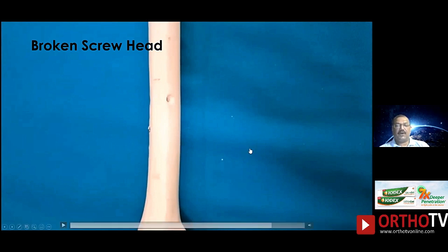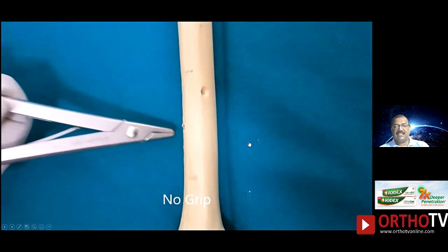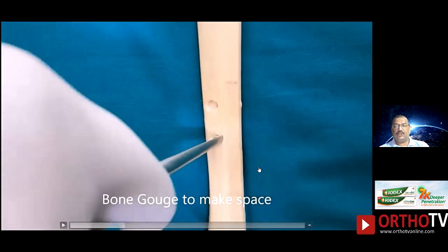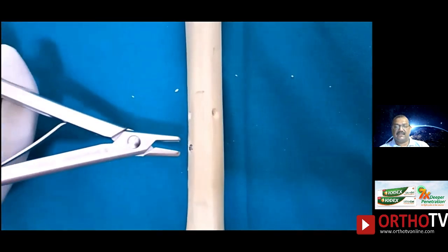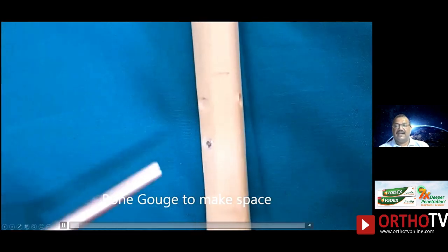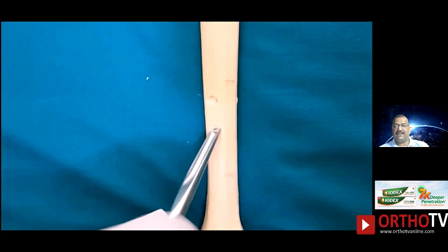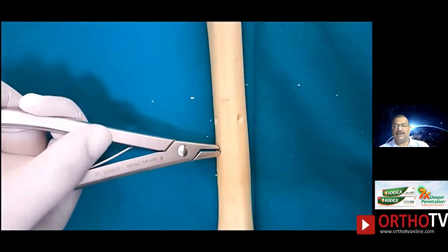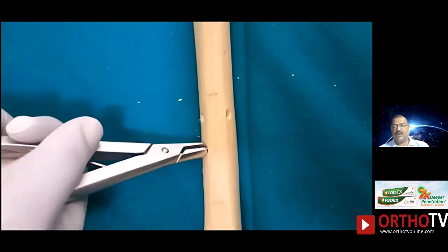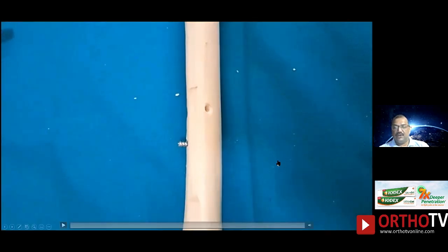Second scenario: if the screw head is broken. In this situation you can't really use a reverse tap because there is nothing to hold the head — your screw holder will simply slip off. In this scenario, what you need to do is make space by gouging out the near cortex using a bone gouge. Once you gouge it out, you can get a better grip. Use a bone gouge to make space around this screw shaft, then use a gripper to gradually take it out thread by thread.